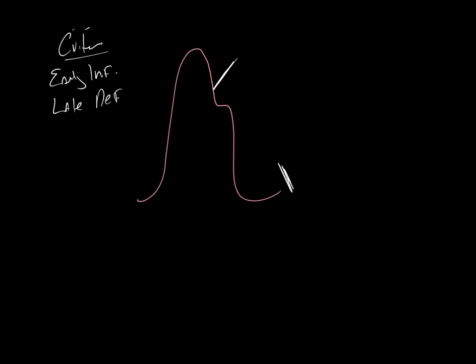What kinds of special things do we monitor with the balloon pump? Anything special like pulse oximetry or pulse checks? Check bilateral blood pressures. Good, bilateral blood pressures and bilateral SpO2 probes, right?